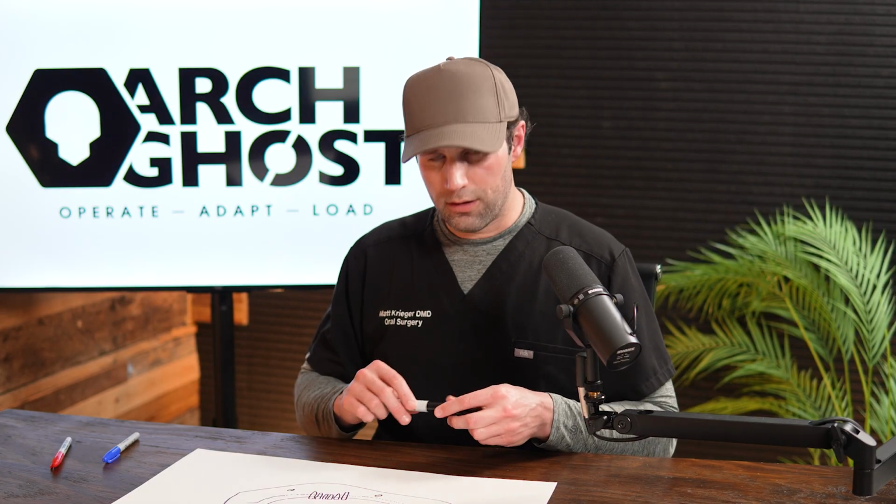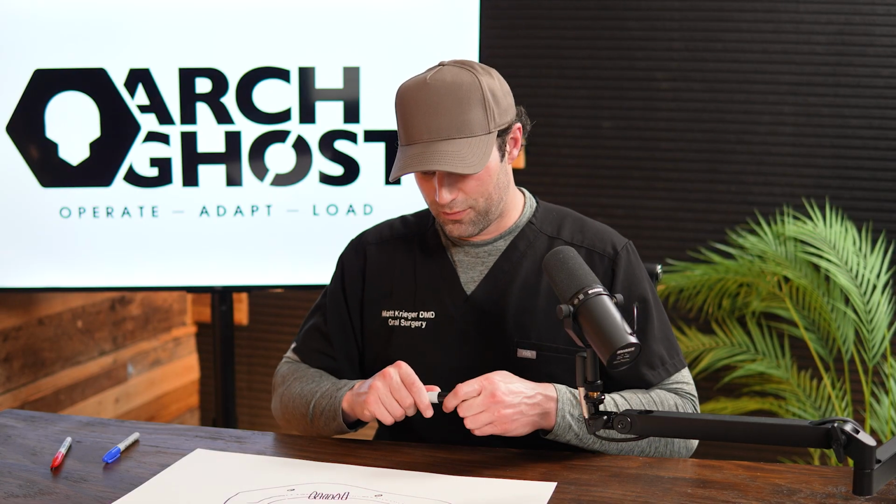So that's it. There are many more reduction points. We don't have time to go over them all today. We'll cover those at another time, and definitely all things that we cover in our Arch Ghost courses. But 5 key points that I think you really should be using: the Edentulous midline measurement, any socket or defect, the canine apex, the apex of the mandibular central incisor socket, and the external oblique ridge.